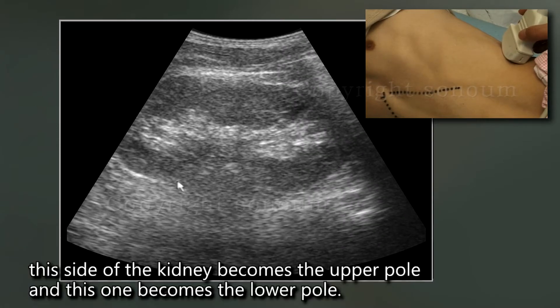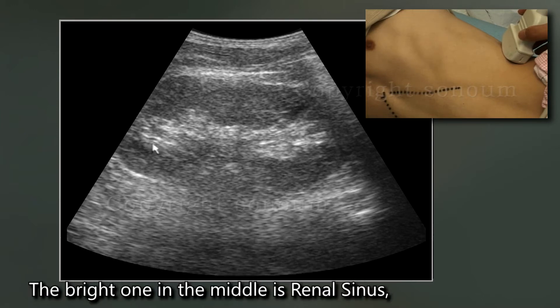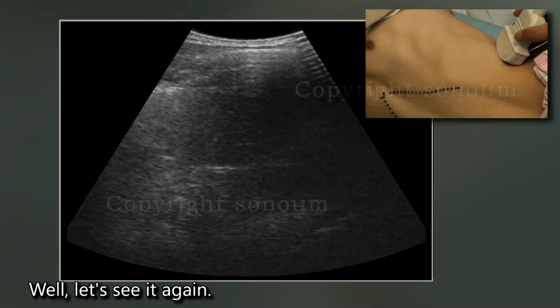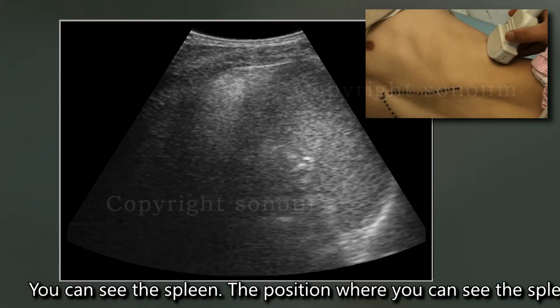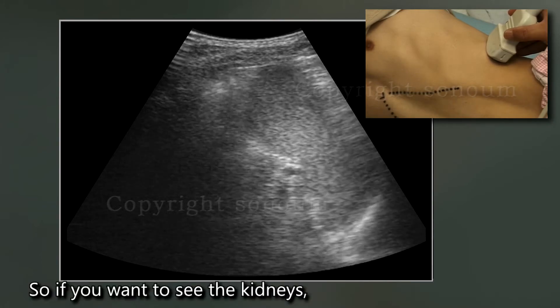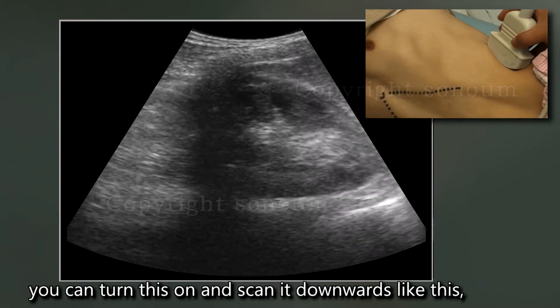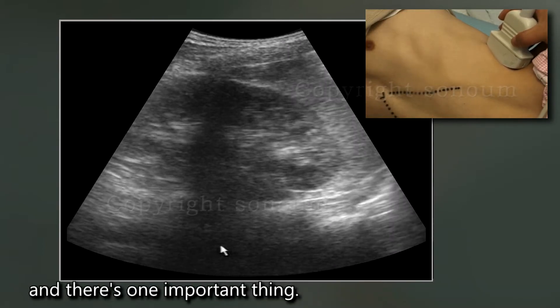At this time, this side of the kidney becomes the upper pole, and this one becomes the lower pole. The bright one in the middle is the renal sinus. This is the renal cortex. You can see the spleen — the position where you can see the spleen is at 7 o'clock. If you want to see the kidneys, you can rotate the probe and scan downwards like this.